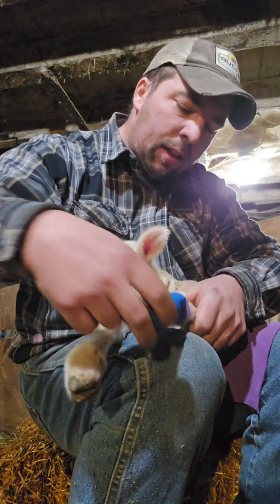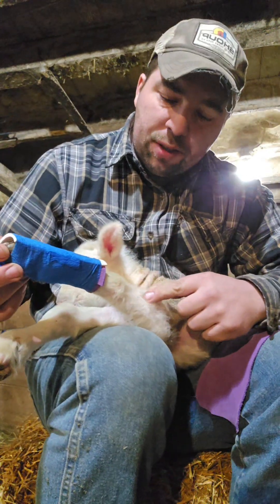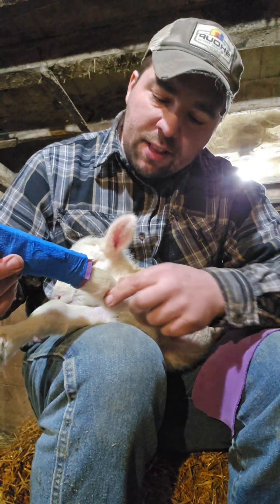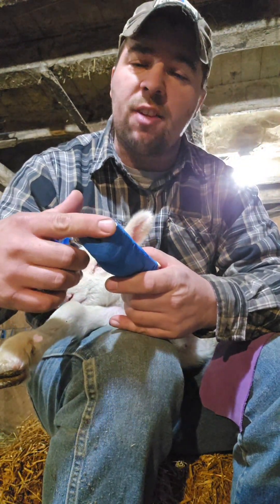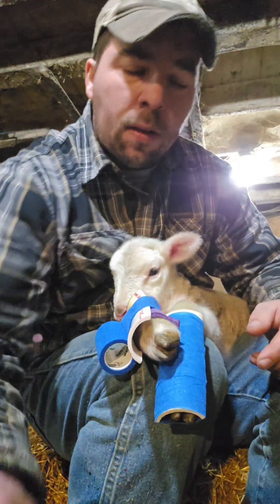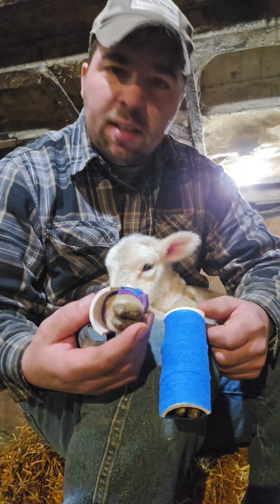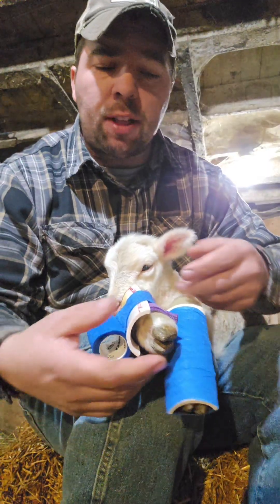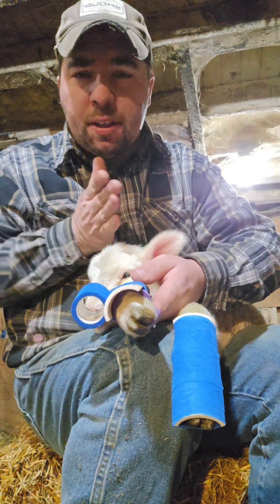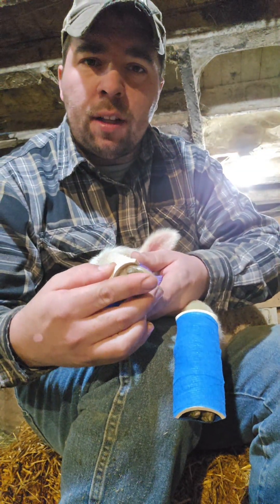And there we go — that's a splint. Now he will gradually stretch this portion of his leg out; both of these ligaments are a little bit short. But as he walks on this, we're just making sure that this hoof stays in contact with the ground and that he's not walking on the front of it. Now one other note: sometimes with these things the leg will have a little bit of a twist to it. There was a lack of space when he was growing, so this second splint isn't actually lining up with the direction of the radius of his leg — we're lining it up on that hoof. That's the goal.